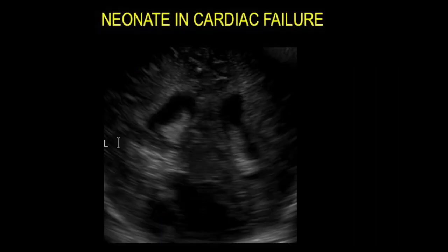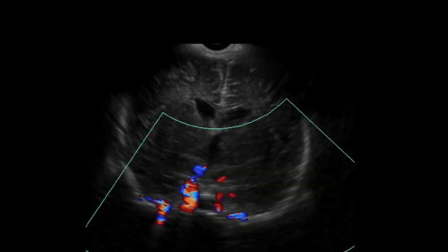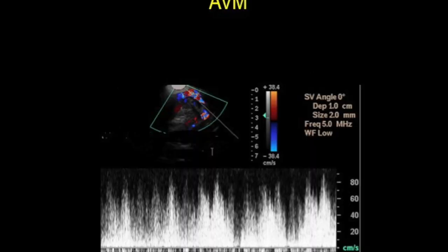This case was a neonate in cardiac failure. On ultrasound you can see a posterior cystic area which on color filled and showed aliasing, with a lot of color signal. This was a congenital AVM and the child had presented in cardiac failure.